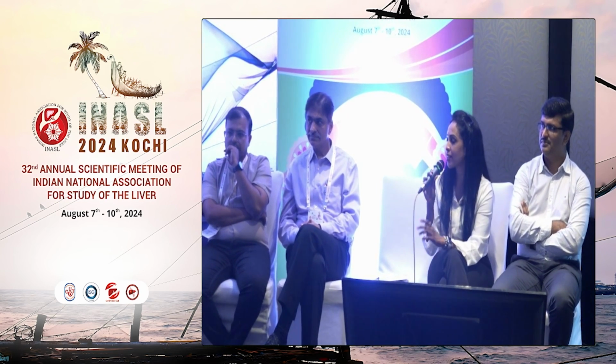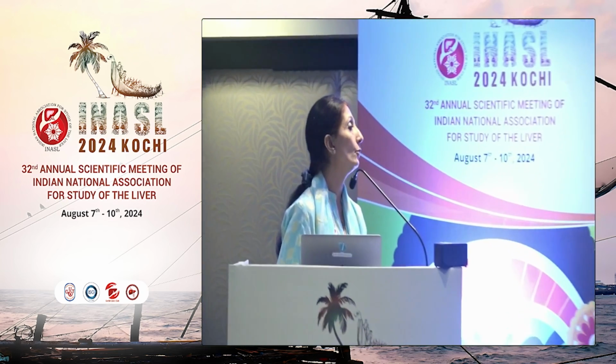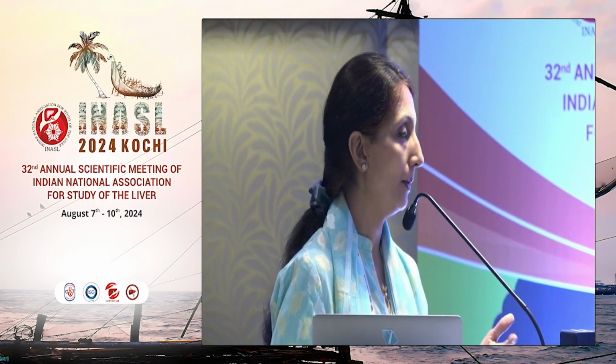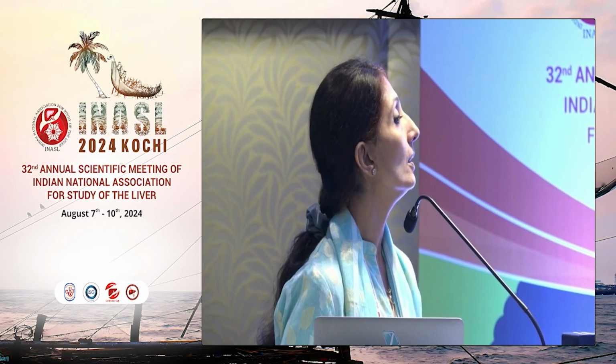Just one question. Regarding the role of elastography, in prevention for patients, and also as a follow-up post-treatment, have you been doing it? Yes, elastography is a well-documented modality, but what would you really want to use it for once you've diagnosed a lesion, unless you want to follow up a change in malignancy?